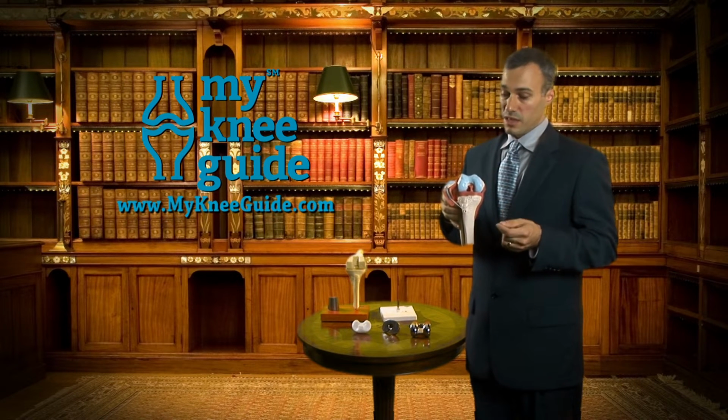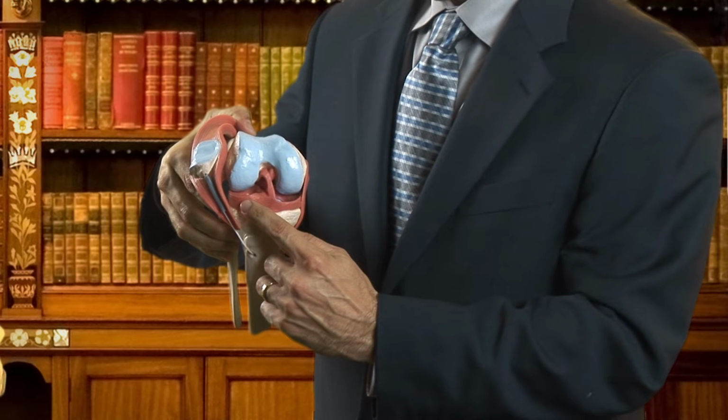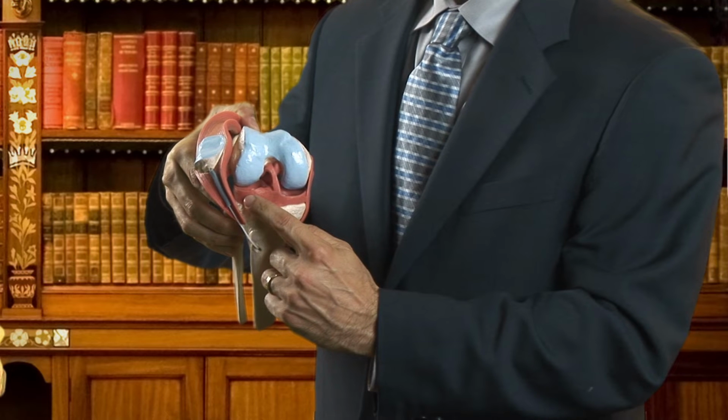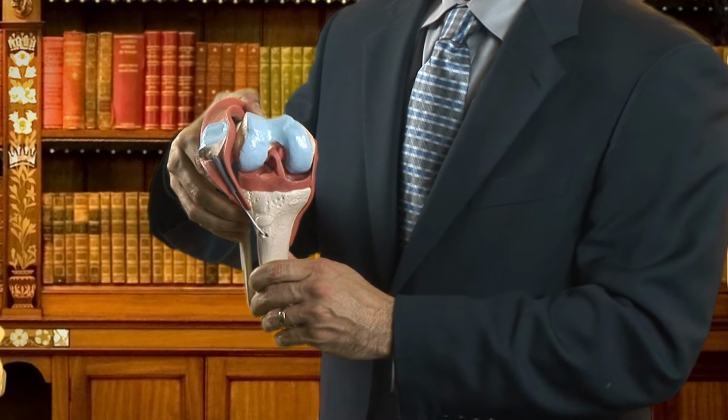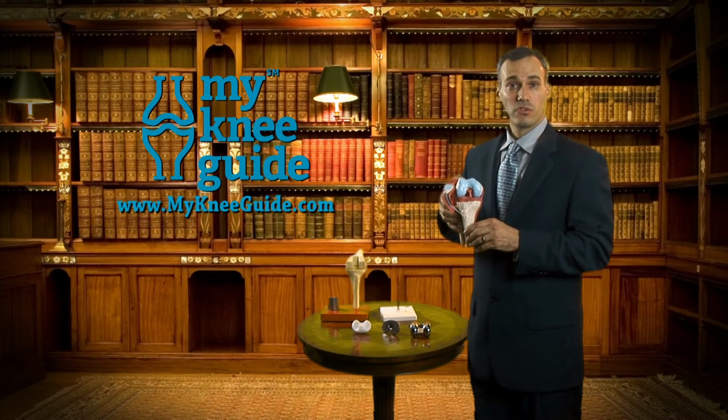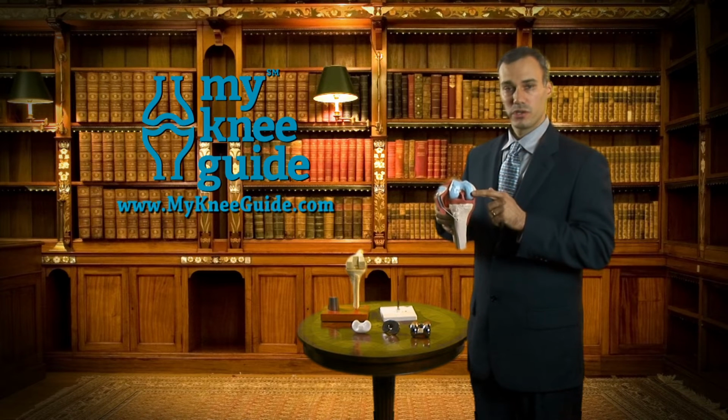This now gives access to the menisci, which are the cushions that sit between the thigh bone and the shin bone. Typically, in the arthritic process, there will have already been some destruction of the menisci. The surgeon will remove the remnants of these structures. We now have very good access to the deep bone structure.